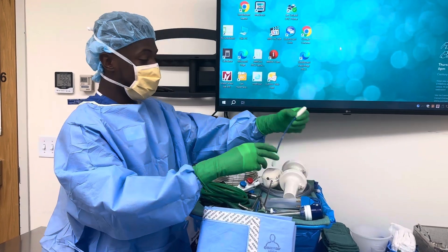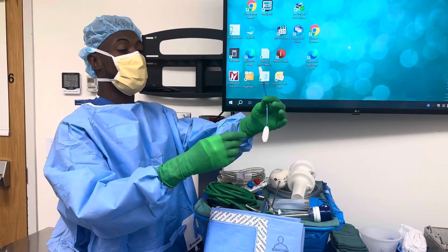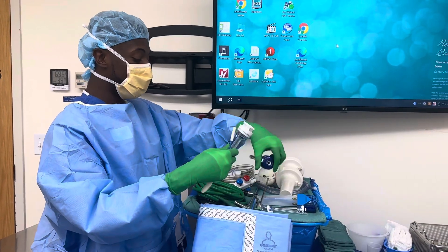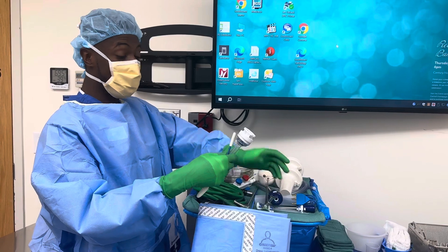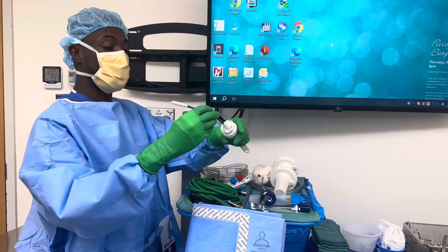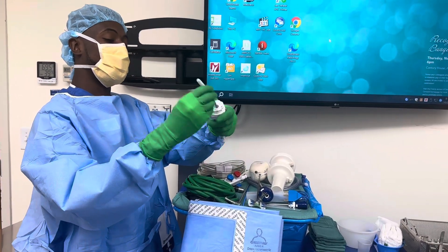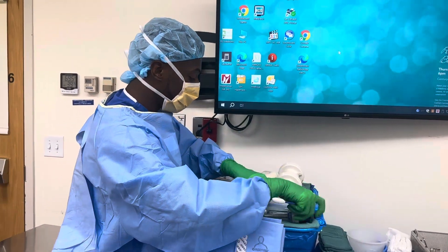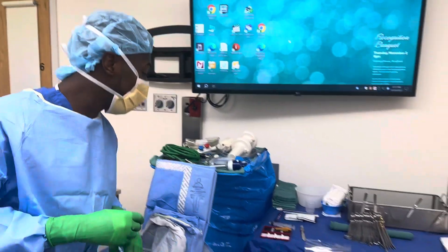This comes with the igloo — some people call it a tampon. It's used to clean out the port, so if you get blood in the port it can obstruct your vision because it can make the smoke kind of bloody. We'll just put these in there to make sure there's no blood.